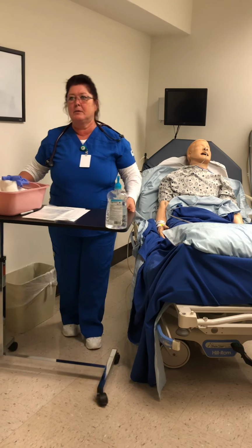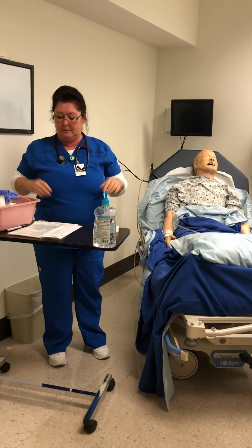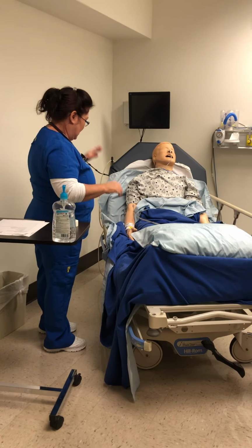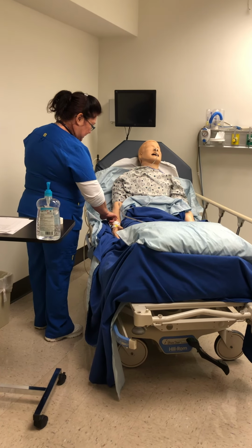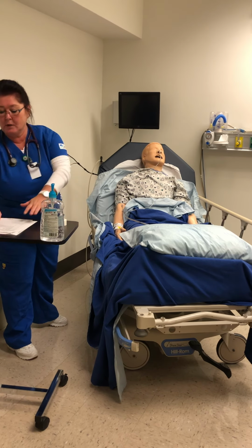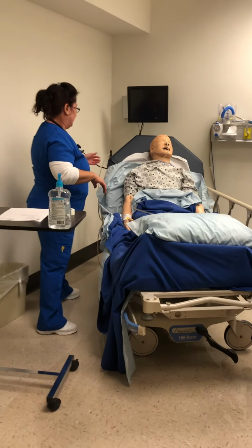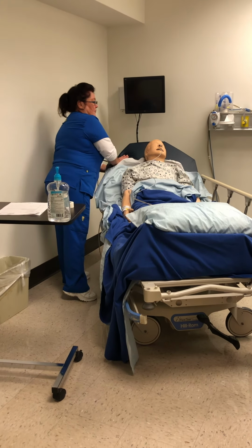So I've left the room, x-ray came, and now I'm coming back to take the tube out. So back in. Hi Shirley, how are you? Good. Again, let me confirm your name. Shirley Cost, 5/14/1964. Okay, Shirley, are you ready to get that tube out? Perfect. Well, we're going to assess your bowels again real quick. So I'm going to lay you down.